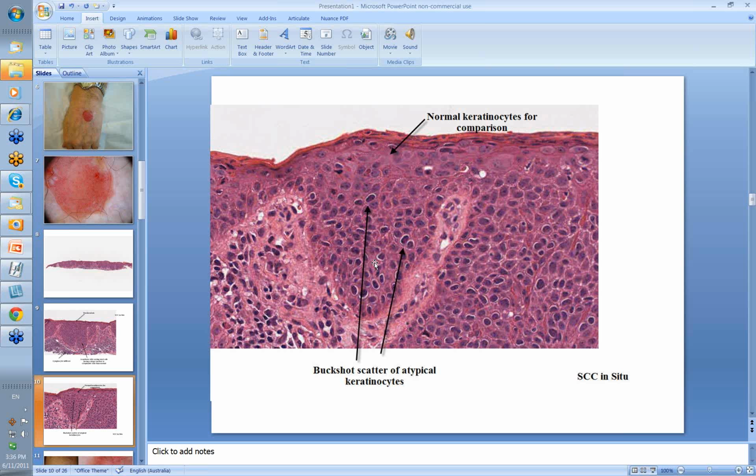this on a mucosal surface, particularly on the penis, where this tumor, an SCC in situ, will present as a glazed red plaque with very defined edges that slowly increases in size. It's possibly due to the HPV virus, but it's the same histological picture that you'll in fact see.